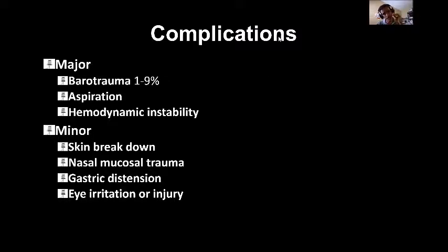If CPAP does not work, usually bi-level CPAP does not work either. Yes, you can try. There is no science, but you can use CPAP for apnea, and you can use bi-level CPAP. You can trial and error. There is no science behind it. People say there is no difference. But if you use a good CPAP, you will avoid bi-level CPAP. But yes, you can use bi-level CPAP for apnea. You can use nasal high frequency for apnea too.